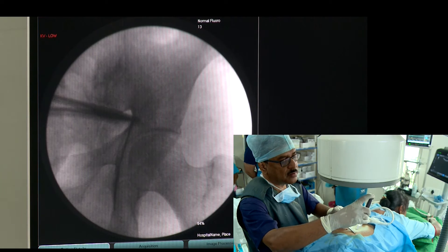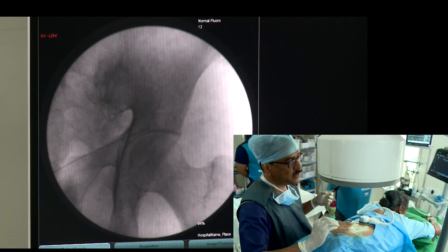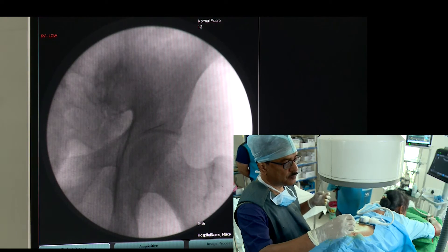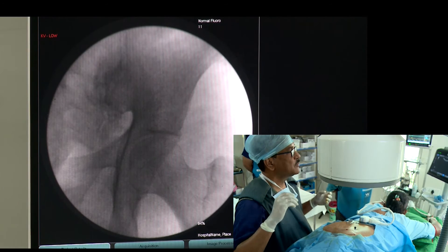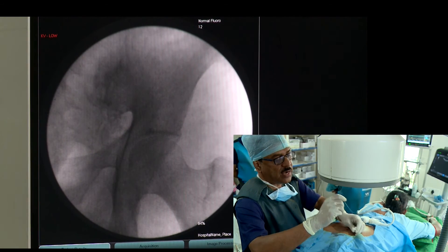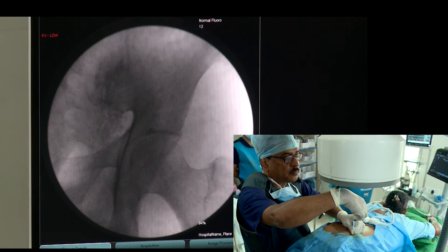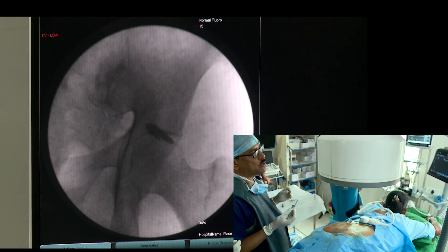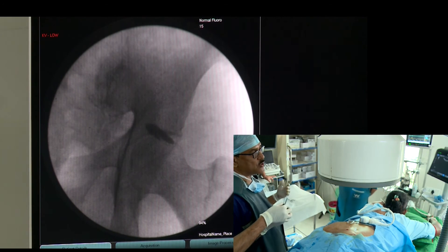The needle is placed perpendicularly — I am checking where my needle is going, just above the acetabulum, just perpendicular. I am hitting the bone there, so I will change the tunnel vision slightly, withdraw a little bit, and then inject dye. This is a very beautiful dye spread. The forceps are showing you the direction of the piriformis muscle — it is along the direction of the piriformis muscle.